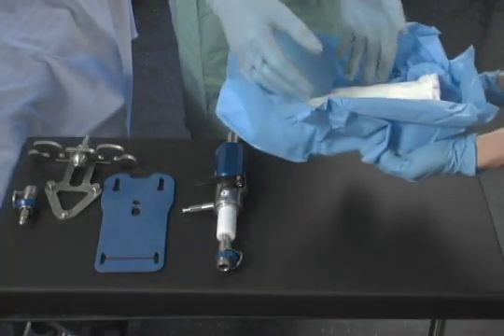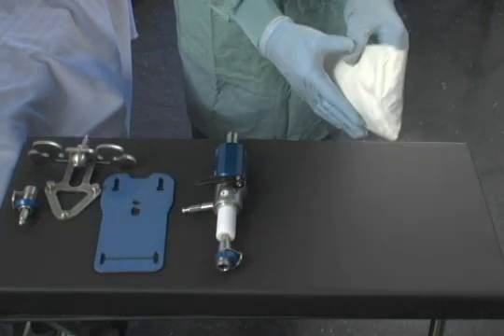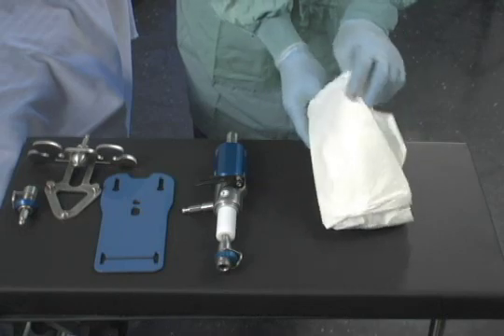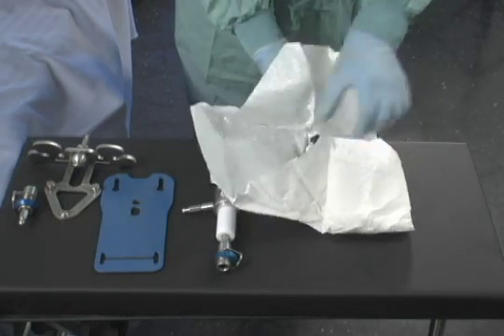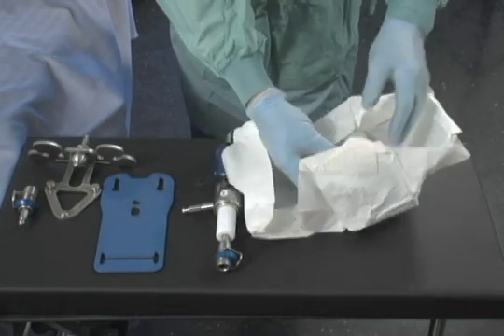While the patient is being prepped and draped, the sterile components are assembled on the sterile back table. A piggyback, a traction accessory, the wrist arthroscopy accessory and hand plate, and a sterile kit are provided. The sterile kit is opened and the components are placed on the table and assembled.